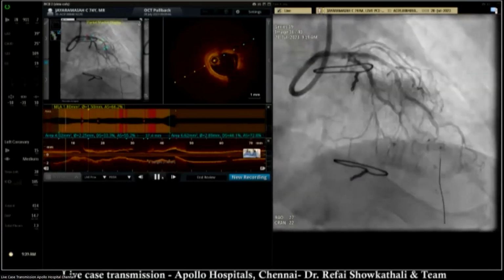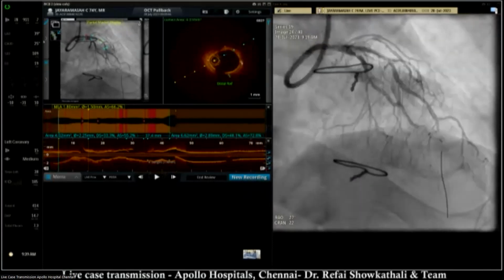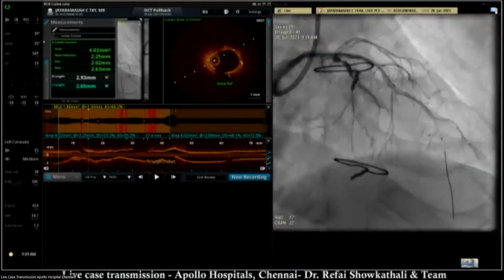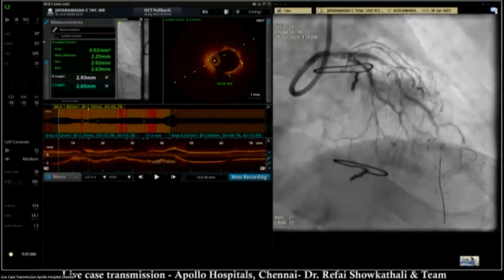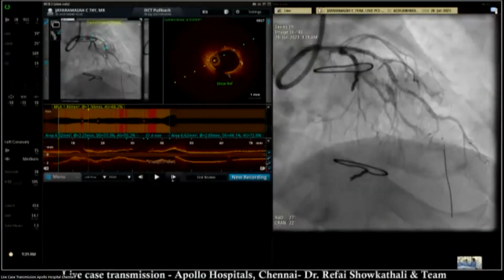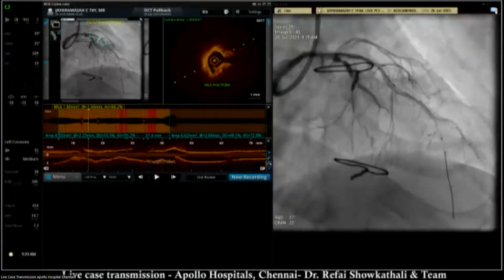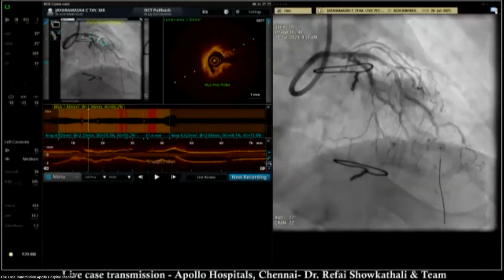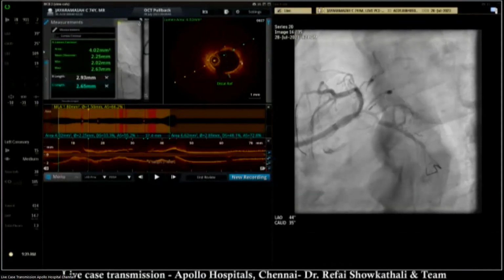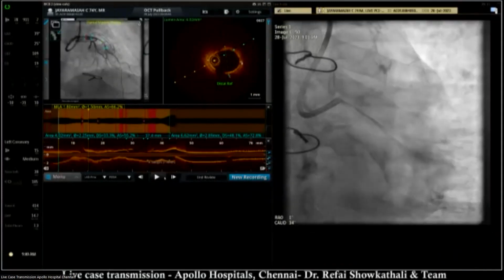And this is a great case for very good stenting. I would, however, use a scoring balloon. I use AngioSculpt. Right. The only question, the reason I was asking about that is the distal flow, Refai, is not so great, right? Yeah, the distal LAD. I may show you the last picture after ballooning. We took one picture after ballooning. Okay, sorry, the screens are not clear for you. The next one will show.